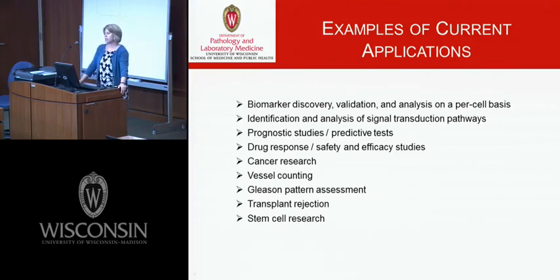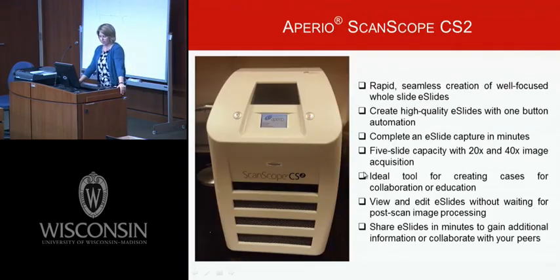So what are some current applications of this multiplex modality? Individuals are using it for biomarker discovery, validation, and analysis, identification of signal transduction pathways, prognostic studies and predictive tests, drug response, which is a very hot area here within our cancer center, cancer research, vessel counting, Gleason pattern assessment, transplant rejection, and stem cell research. These are just a few areas where this type of technology is being utilized.